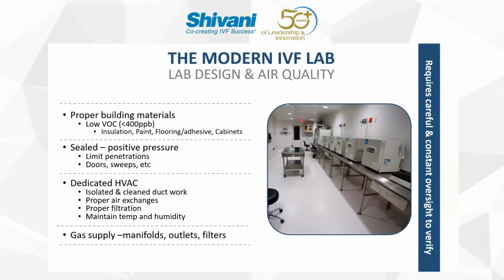As we've discussed at length already, proper lab design and execution are critical to maintain air quality. We talked about proper building materials, insulation, paint, flooring, the adhesive in the flooring, the type of cabinets, all critical, because if they aren't the proper material from a VOC or air quality perspective, all of that pollutant is now inside your lab. And if these labs are sealed up, as we've talked about, they have no way to escape. So you want to have a dedicated HVAC system, meaning some way to clean that air. If you have a centralized HVAC system, it's isolated from the rest of the space, so you're not pulling in dirty air from an OR that might be using some toxic disinfectants, or a waiting room that maybe isn't as well policed in terms of the low VOC building materials.